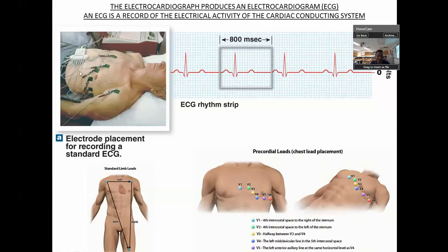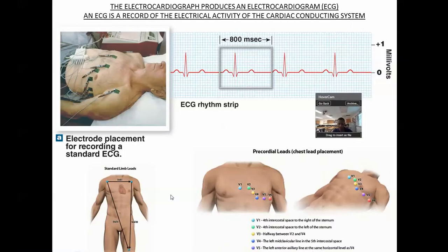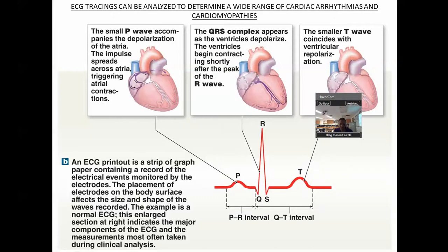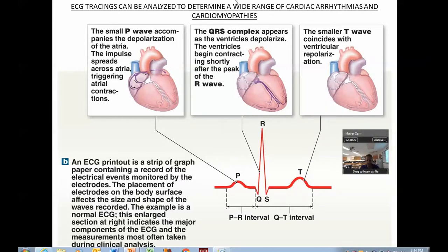This is a lot more elaborate than what you would see in a hospital, compared to what we use here in a high school anatomy and physiology lab. And of course the purposes of this, and if you're one of my students, you can pause this for a second and take a larger picture. This is actually from a PowerPoint from your notes. So here's again the intervals.